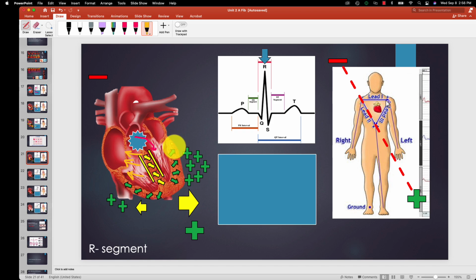So this entire muscle has to be stimulated by depolarization of the contracting cardiomyocytes, and it's kind of going out in various directions. So this is where the machine is super, super smart. So I want you to look at the difference that I have here in positive charges here and positive charges here. And we can see that there's more of them here.